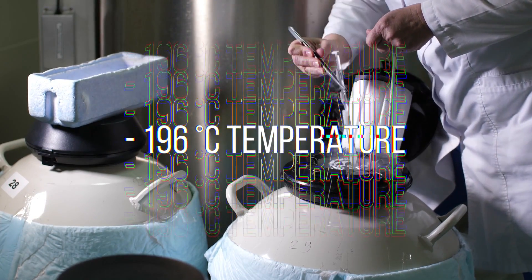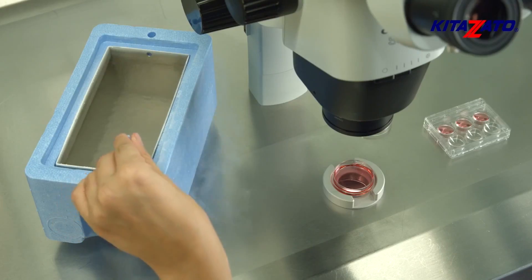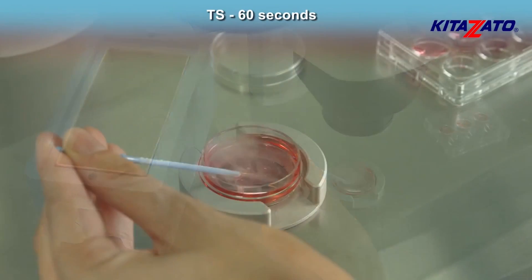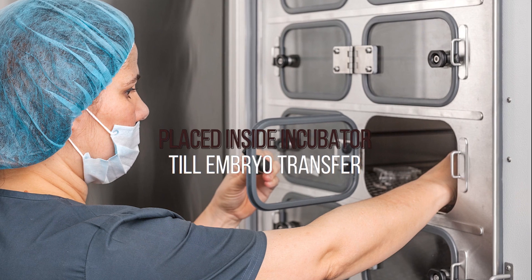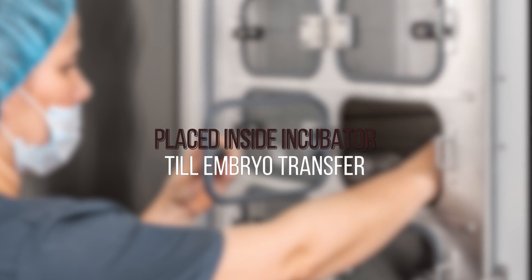So how are embryos warmed or thawed in a frozen embryo transfer cycle? The specific cryostraw with identification details is traced. The cryostraw is uncovered and in specialized thawing media, the embryos are then exposed in a sequential manner with appropriate times. The process of thawing or warming embryos takes around 10 to 15 minutes, following which the embryos are cultured in the incubator for several hours or even overnight, depending upon embryo developmental stage.